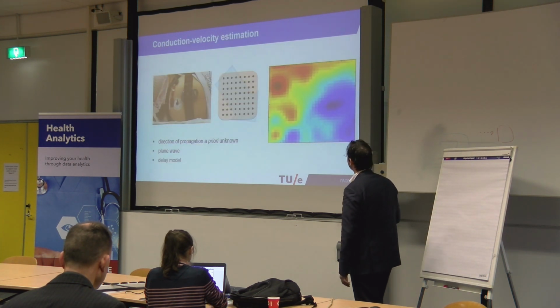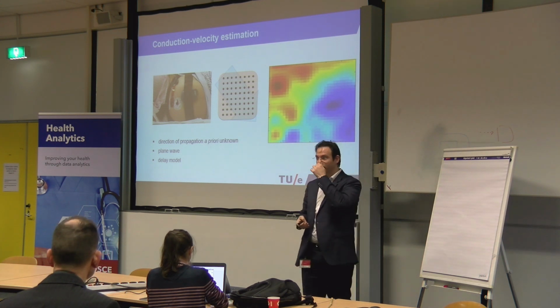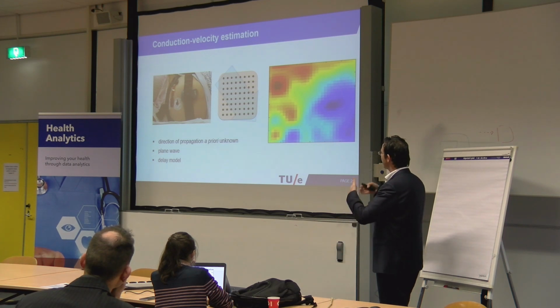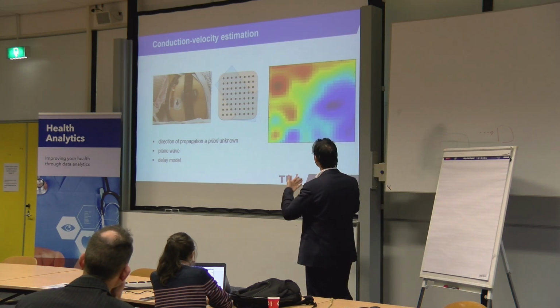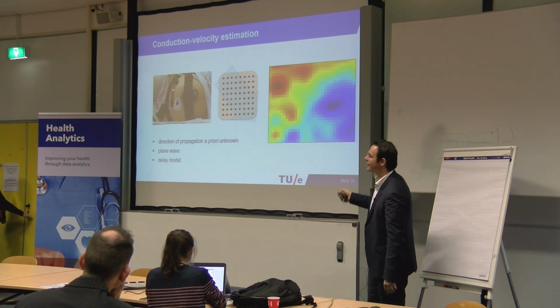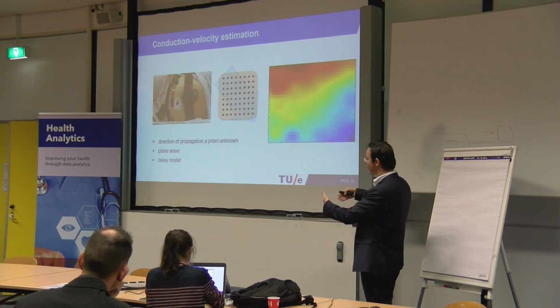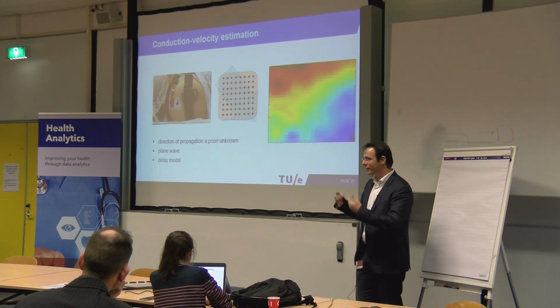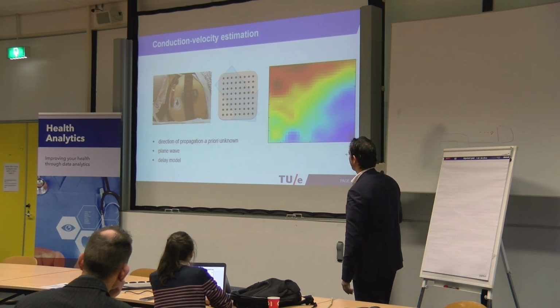And this is actually the very first wave that was measured and that we could also show. For the first time, you could really see the uterine contraction in terms of electrical activity that propagates through the uterus underneath this electrode. You see the red part is higher energy, and you see how it's propagating clearly in one direction through this matrix.